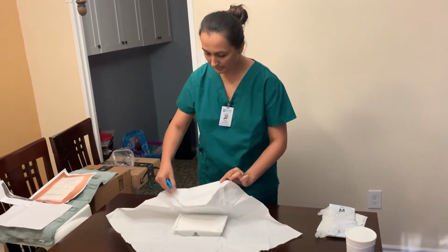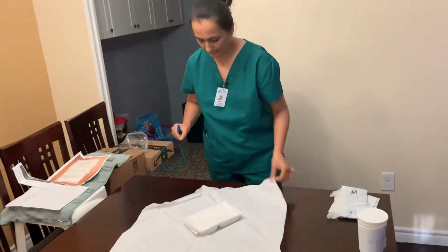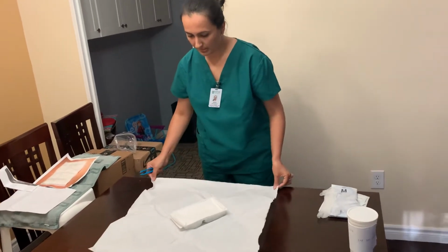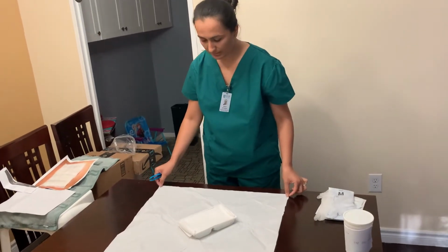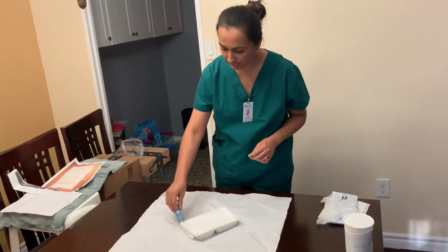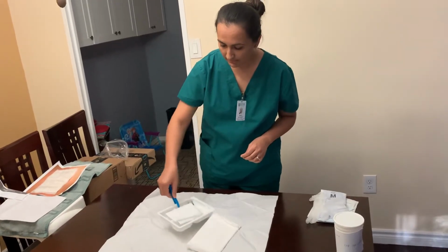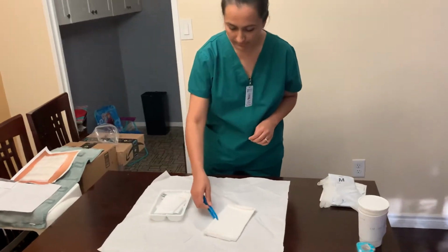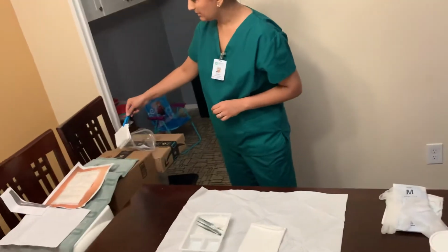I'm only supposed to touch the 1-inch border, and now I'll move this top so it's easy for us. Okay, so I'll move the tray closer here, drop here, and this is the garbage bag. You can keep it here.